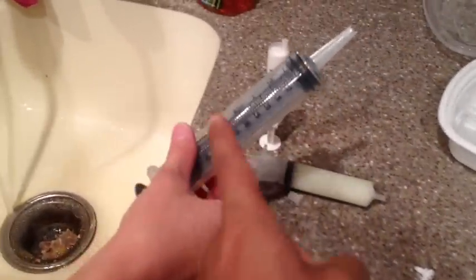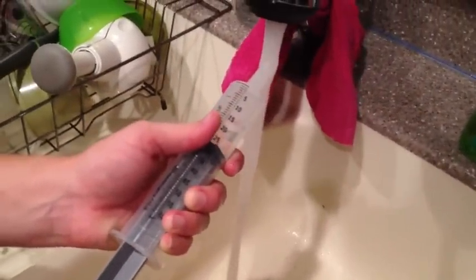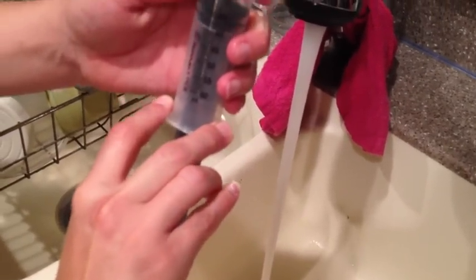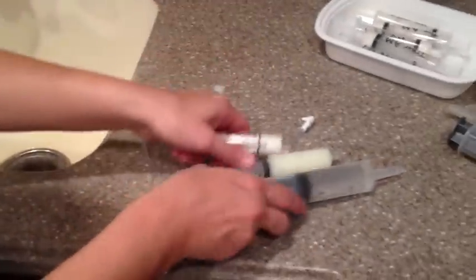Then grab the big tube — that's going to be used for flushing whatever medicine is still left in the tube. Suck water into it; you're going to want around 30 to 35 cc's. Go through that process and fill that up. Once that's ready, we'll head on to his bedroom and give him all of his meds.